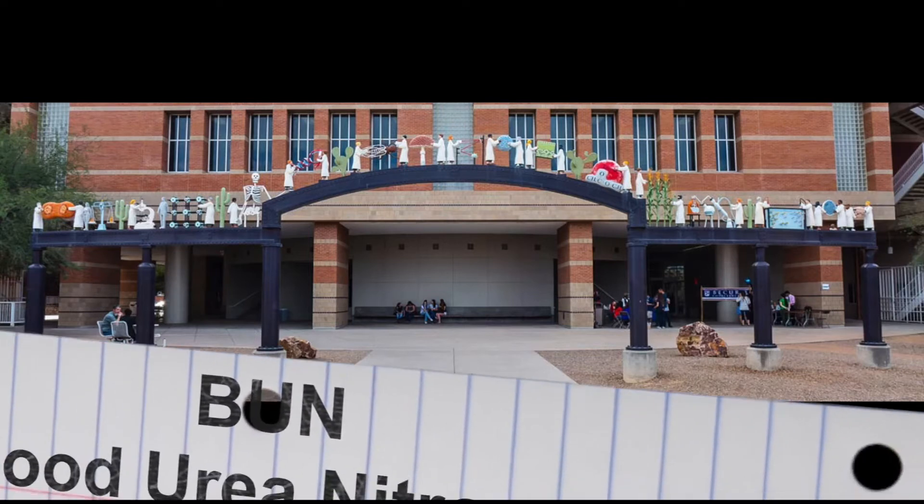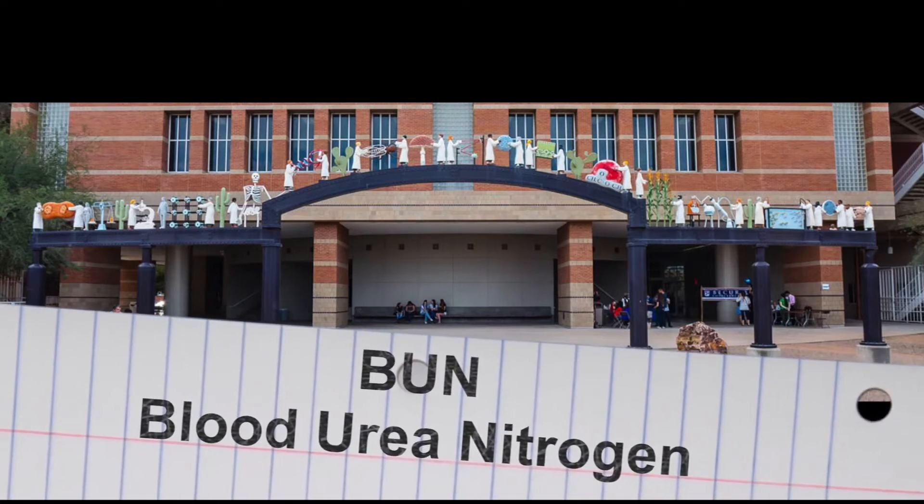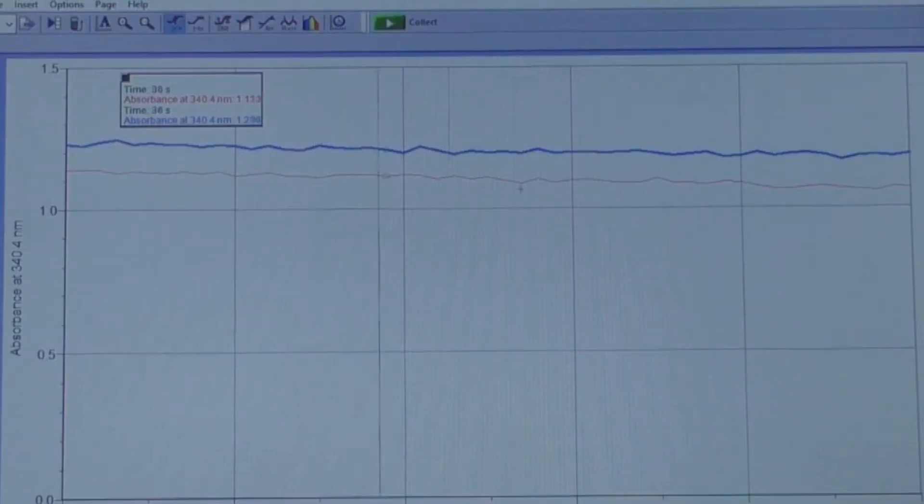This video will show you how to determine the blood urea nitrogen, or BUN level, in a patient's serum sample using a kinetic reaction. You will be observing the change in absorbance in the UV region at 340 nanometers over 60 seconds and comparing your patient sample to a known standard.